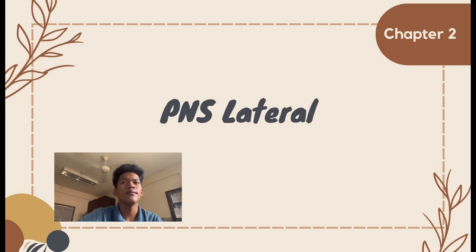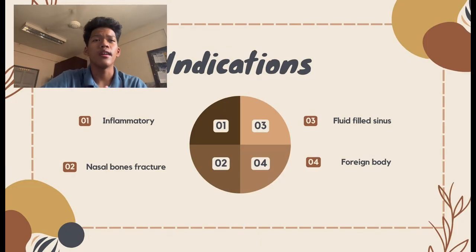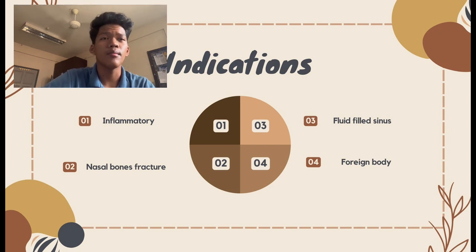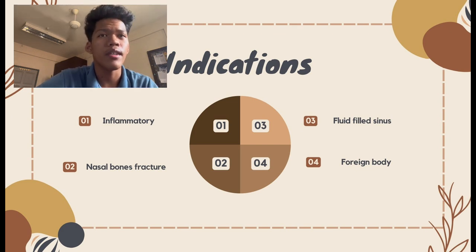PNS lateral. First, we will talk about the indications for doing a PNS lateral. First is inflammatory, second is nasal bone fracture, third is fluid filled sinus, and fourth is foreign body.